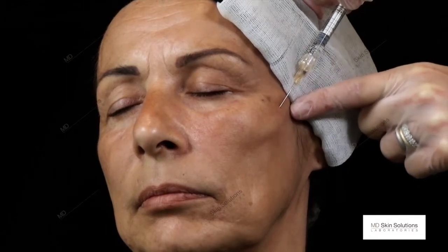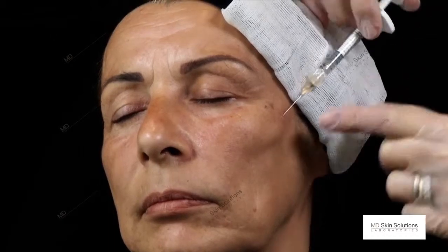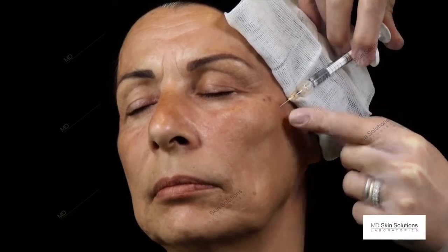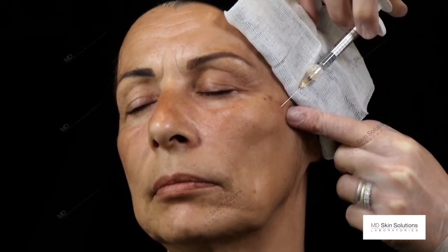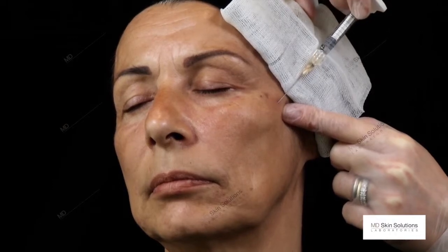This volumizing filler is a very precise one. See how it does a nice definition of the injected area. And now I go do a second pass, advance the cannula, control the tip, and I withdraw. And I do inject the filler in a retrograde fashion, and I do stop before I go out.